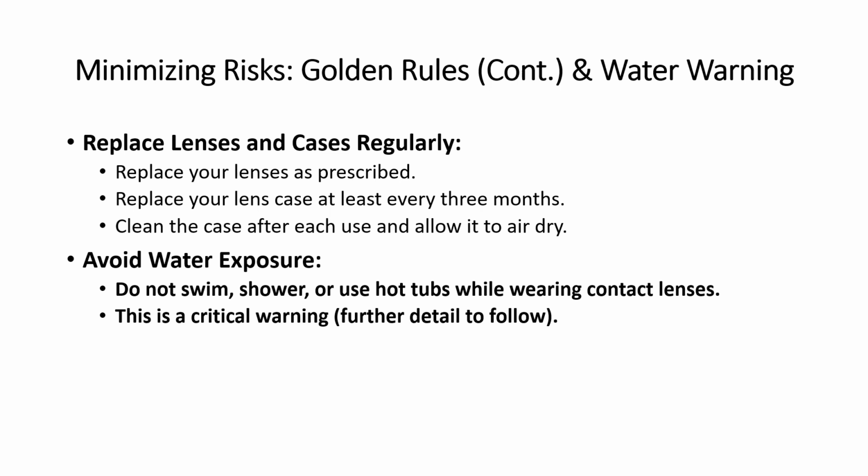And sixth, a critically important rule, avoid water exposure. Do not swim, shower, or use hot tubs while wearing contact lenses. We've discussed this before, and we'll delve into the specific dangers of water exposure again shortly, as it's a significant area of risk for contact lens wearers.